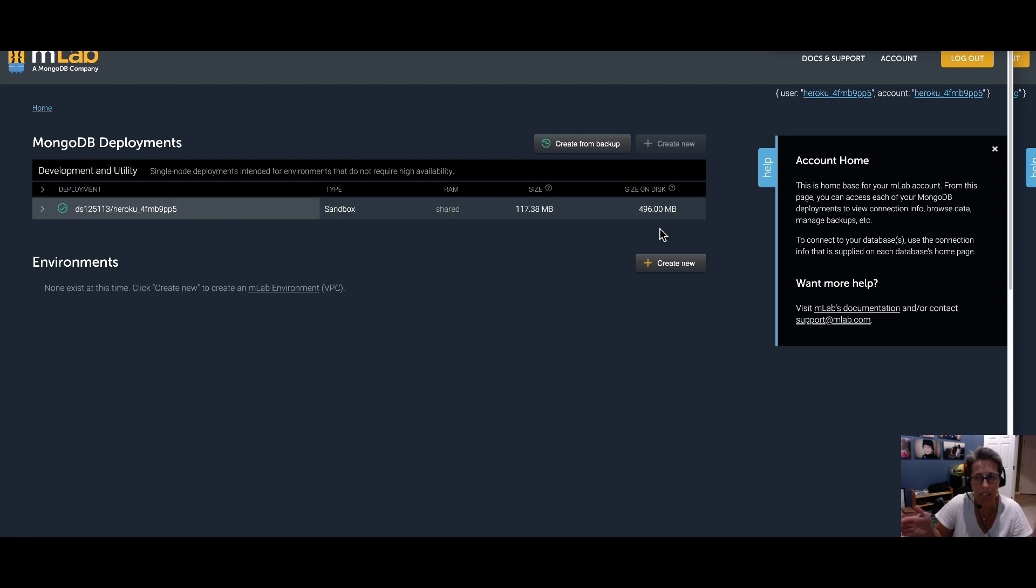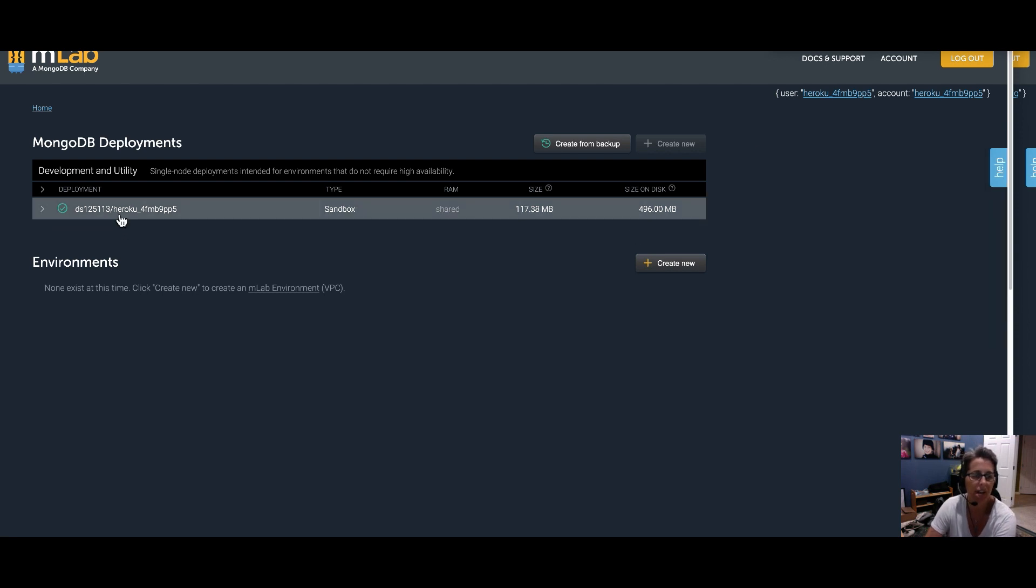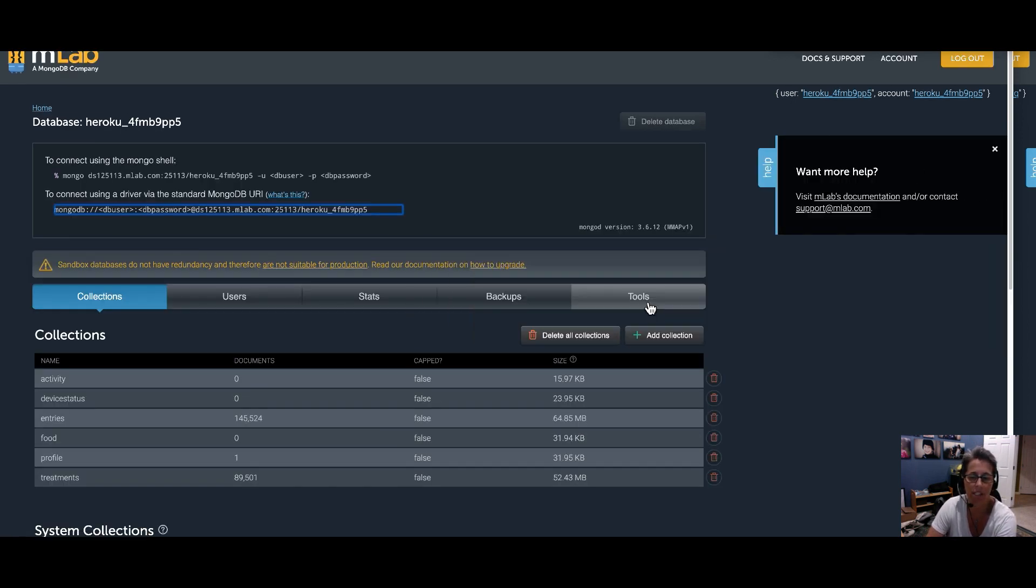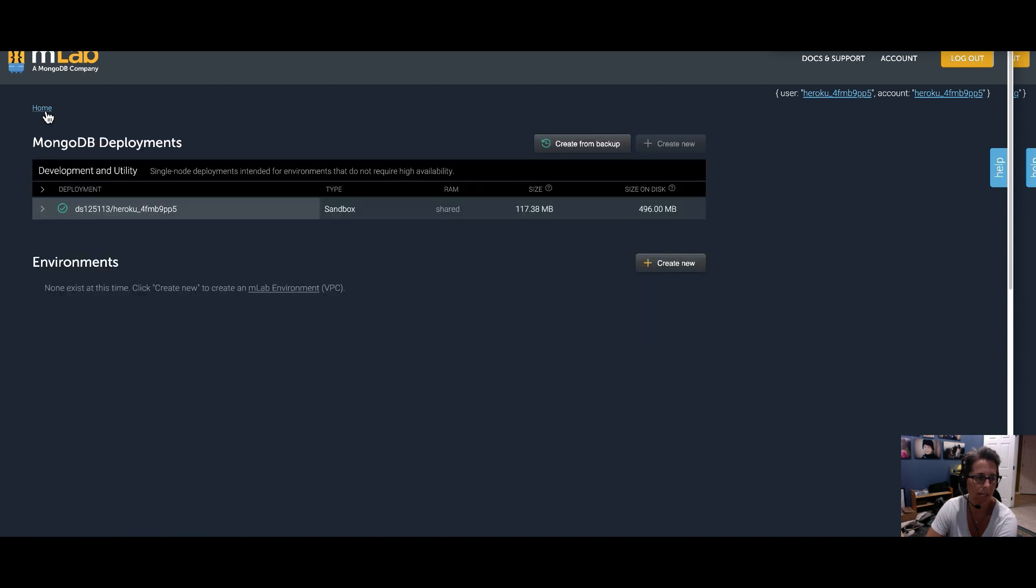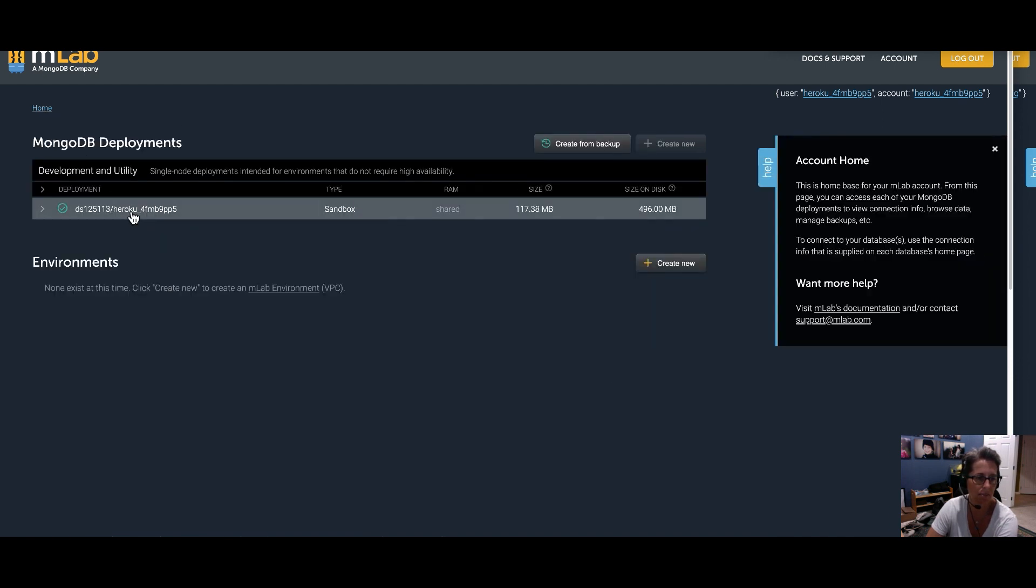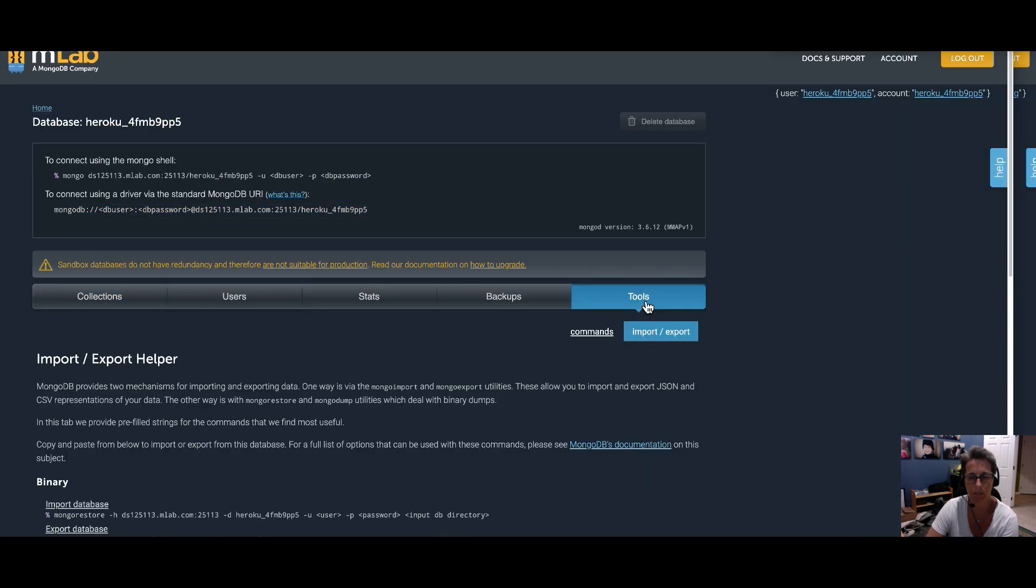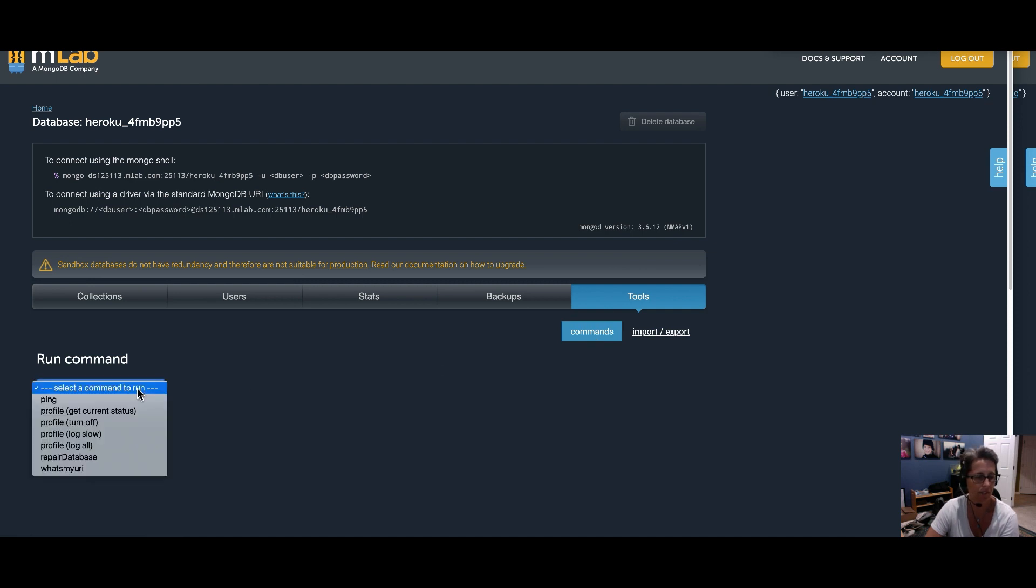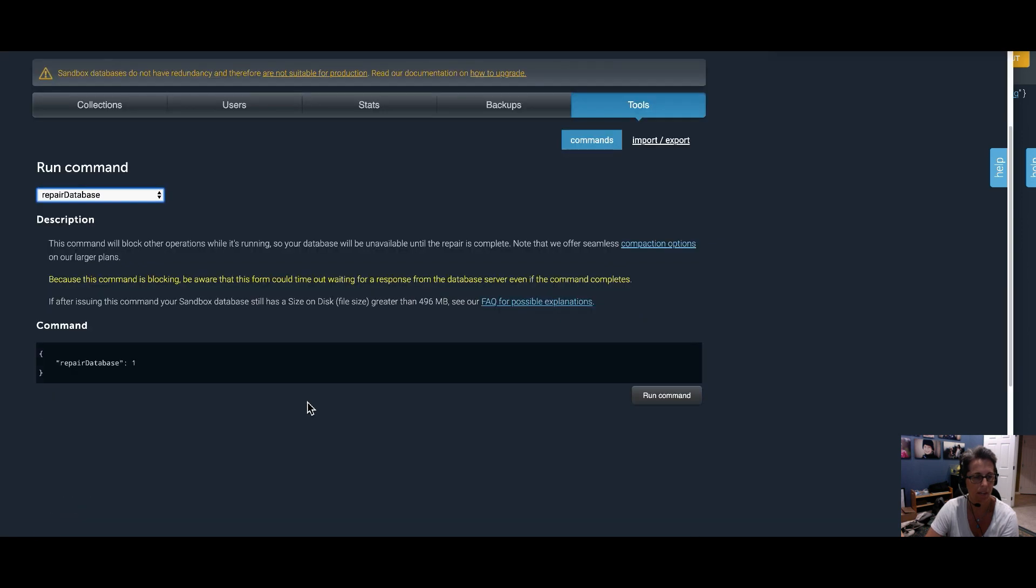So the next thing we need to do is sweep all those grains of rice closer together and make it smaller on the size of disk. And the way we do that is a command that is under the tools button. So the way we're navigating, sorry I didn't clear this out, but home button up at the top and clicking on the database name. Those are our two navigation tools. So I'm clicking on the database name, then we go to tools, commands, and then we're going to select the run command as repair database. And I'm going to scroll down, so you can see the command we're going to issue is repair database. Click on the run command button.